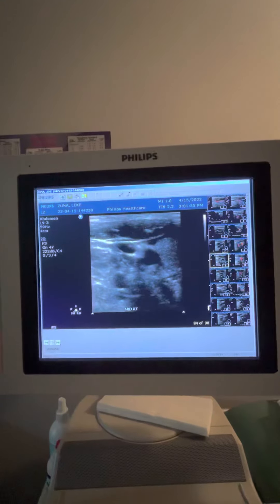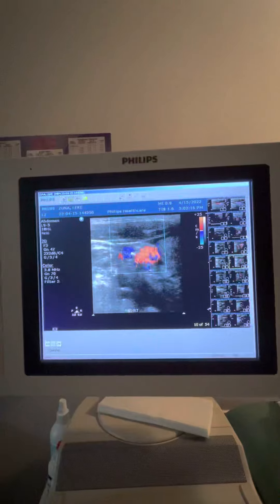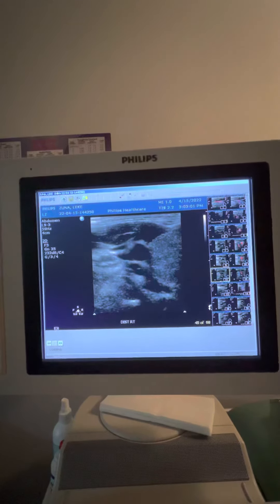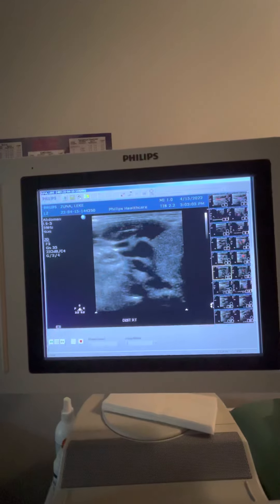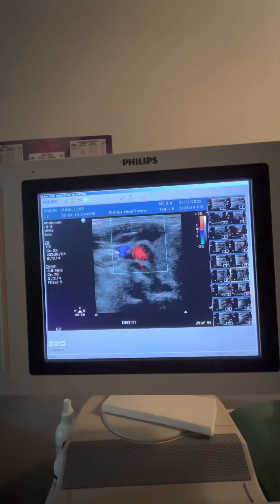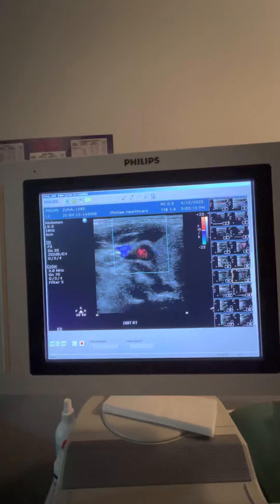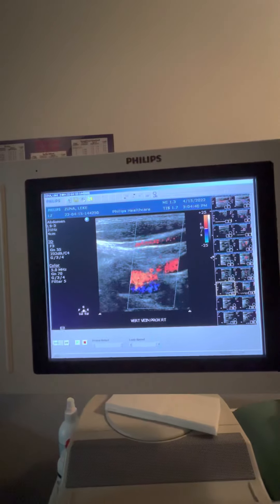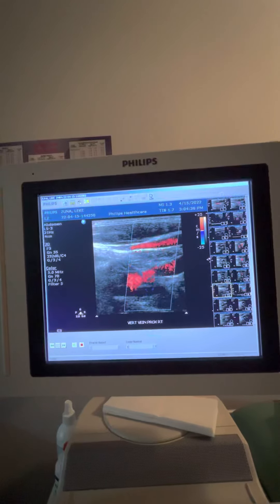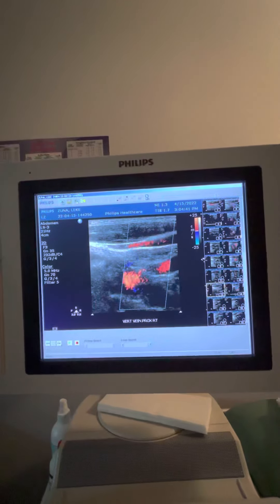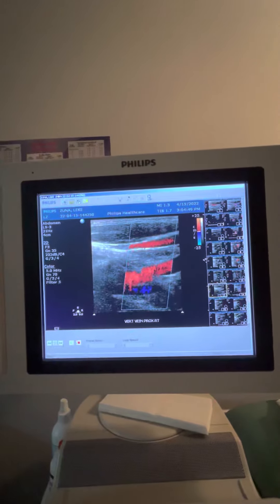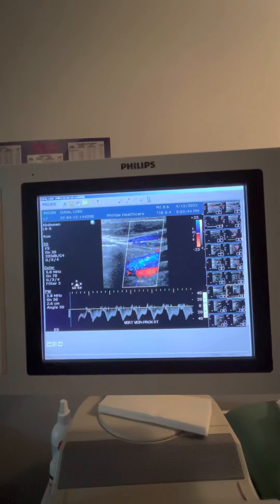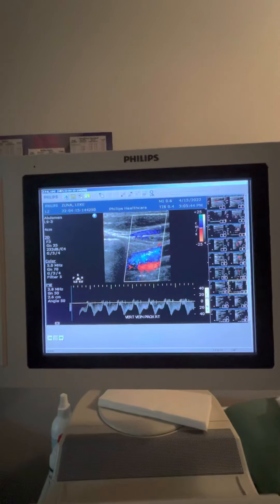Color, mid. Mid color, distal. Distal color, internal jugular vein on top. Anterior, further posterior, the vertebral vein. MAP switch, vertebral vein proximal.